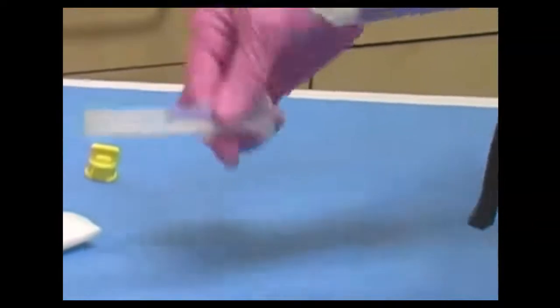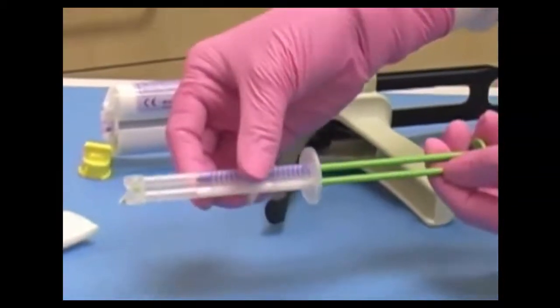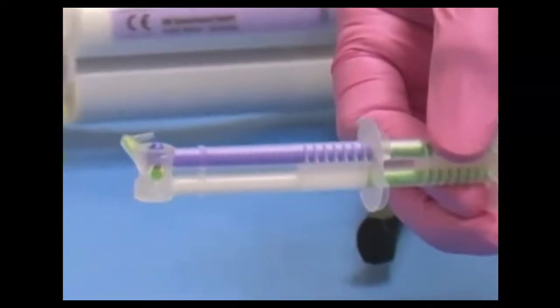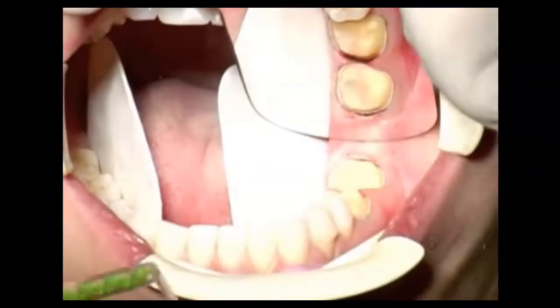Okay, good. Keep it low to the ground. Good. Put the plunger in it. Don't lift it up too high. That's awesome. And sideways. That's excellent. Good. And now bend the thing.